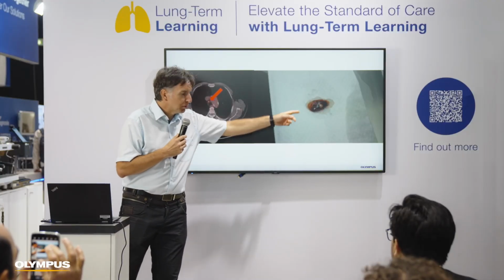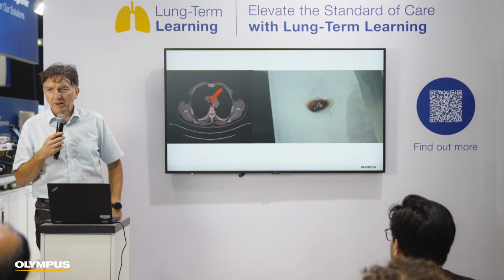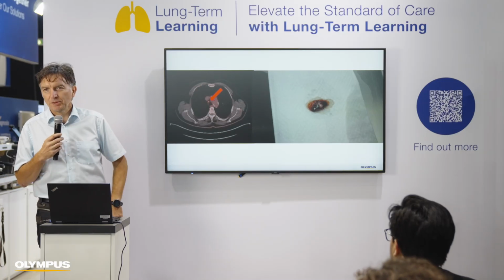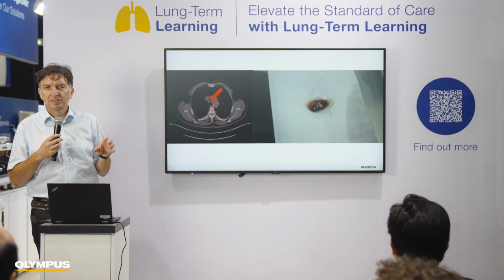The case ended with this: mediastinoscopically the whole lymph node was taken out, as you see it here, and it was indeed granuloma. It was not the relapse of the disease. So the point is that elastography can help us in accurate targeting.